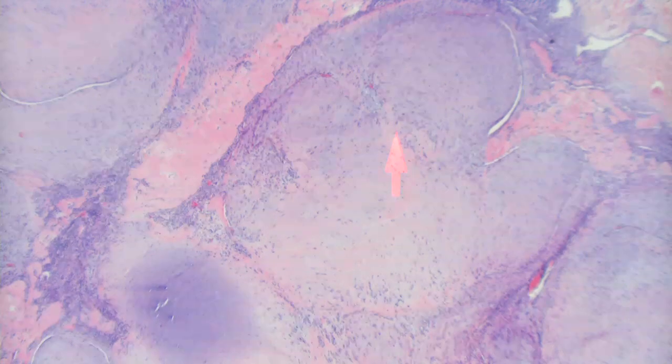A little bit of the fibromatosis. Yeah, good. It's got the same kind of spindle-shaped cells in these areas over here. See some staghorn vessels. Now that's an interesting finding too, isn't it? Good eye there. So you picked up on this sort of change also at the periphery, which is interesting. So how do you wed this with this? So maybe like the adult myofibroma. Sometimes it can look like a hemangiopericytoma. Good. It's kind of a combination of myofibroma and myopericytoma.